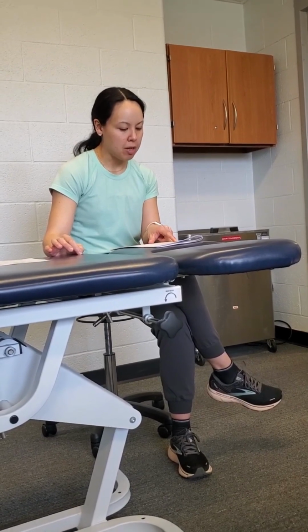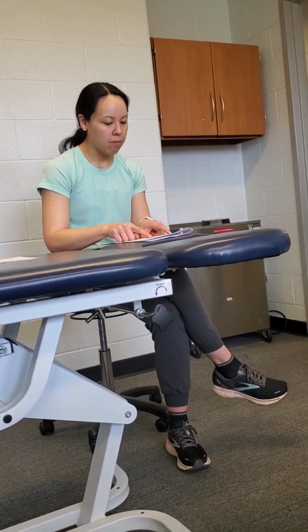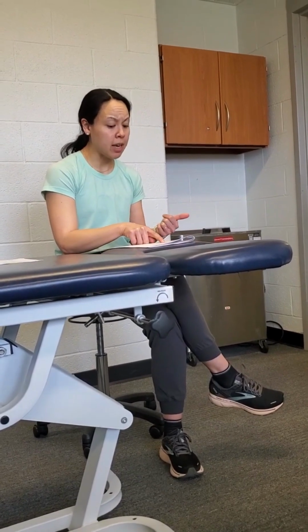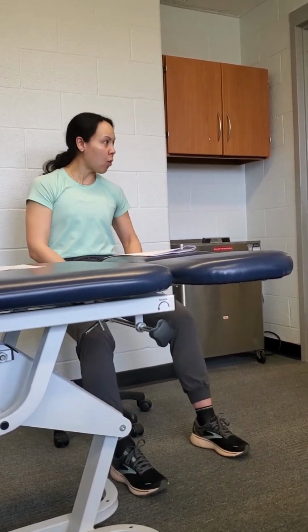Again, generally 2 to 3 times per week for 2 weeks. And another question that came up during the course is whether it is safe to put the e-stim pads under the BFR cuff. So if the cuff is here and you want one of those up here, totally fine. Totally fine.